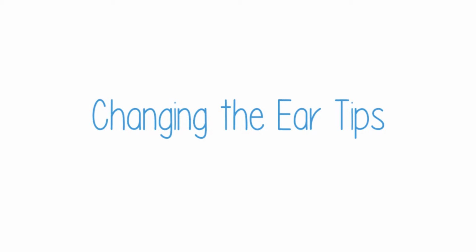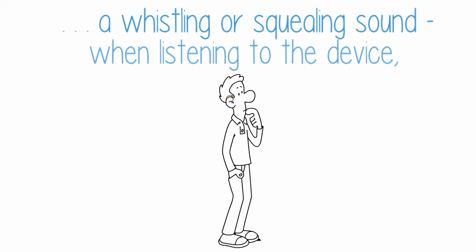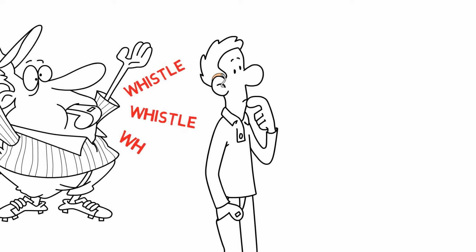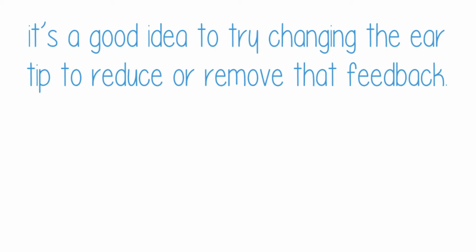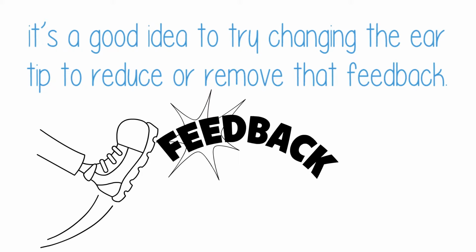Changing the ear tips. If you are getting feedback, a whistling or squealing sound when listening to the device, it's a good idea to try changing the ear tip to reduce or remove that feedback.